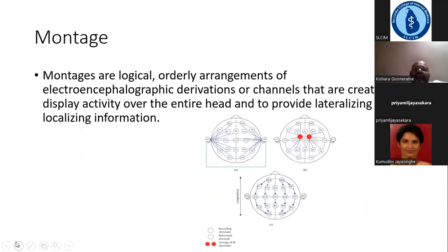I've included some examples of montages at the bottom of the screen. For example, there is this A1 electrode.